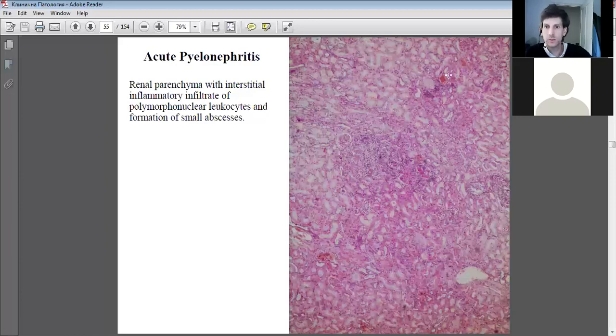So, blood vessel. Sort of a bit of an abscess there. Abscess. Little one there. Abscess. Moving down, oh yeah, there's some good ones here. Actually, probably focus your tutor, your lecturer, on these. These are abscesses here, these ones. And there's a good one here as well, right at the bottom.